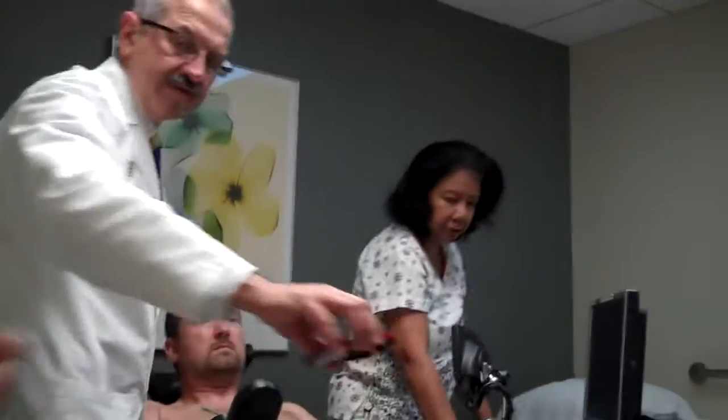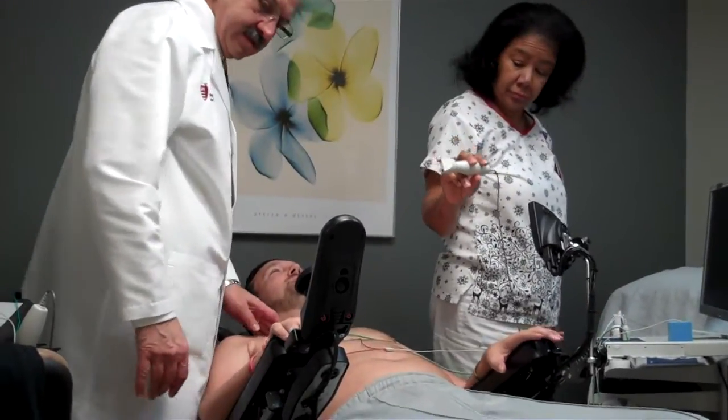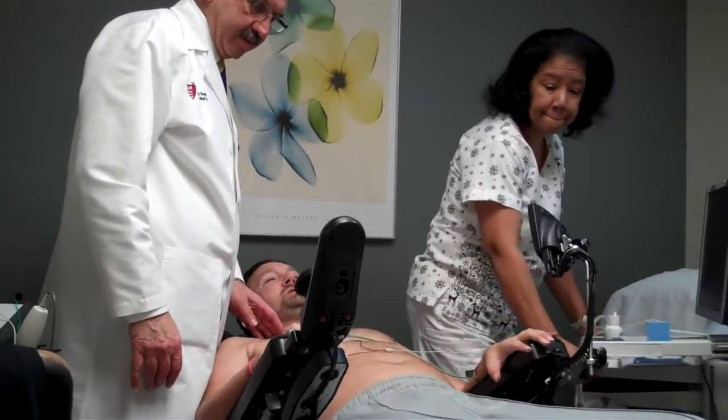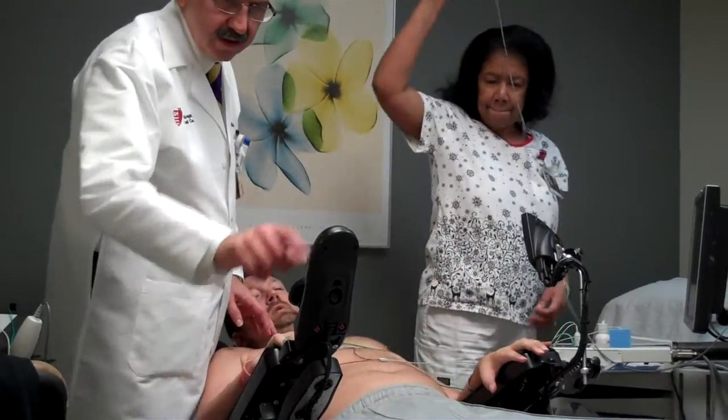I'm going to use his phone so it doesn't fall down. Now can you turn it off? Sure, it's the power button. See the green button on top? This one here.